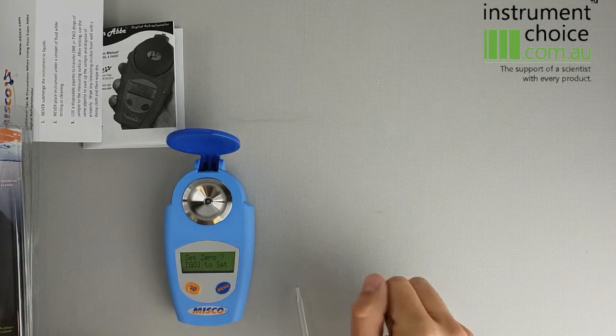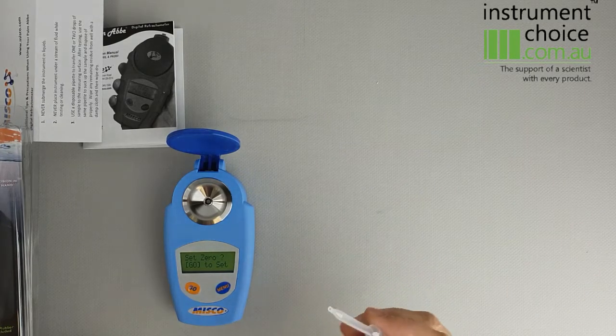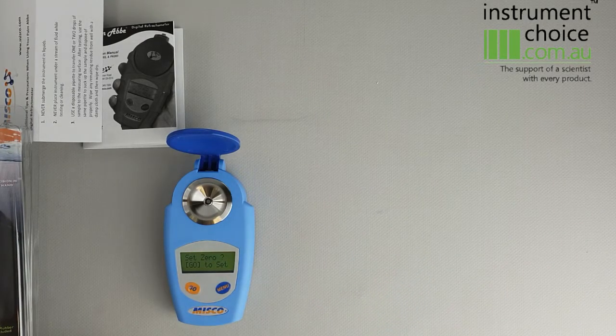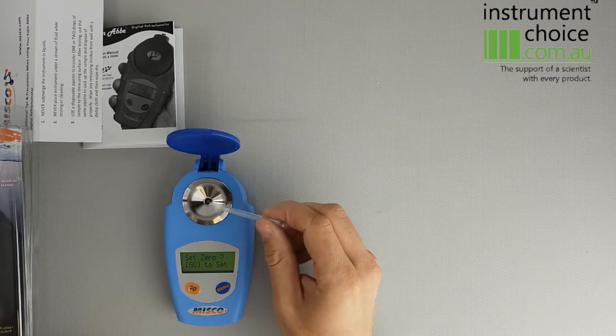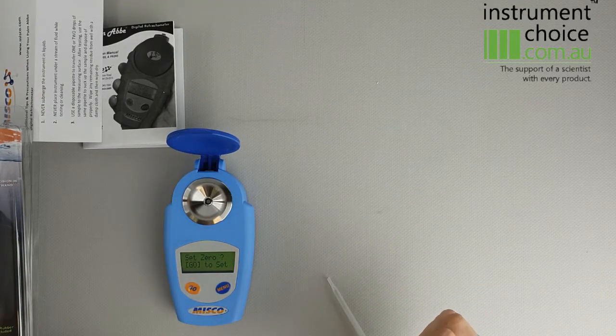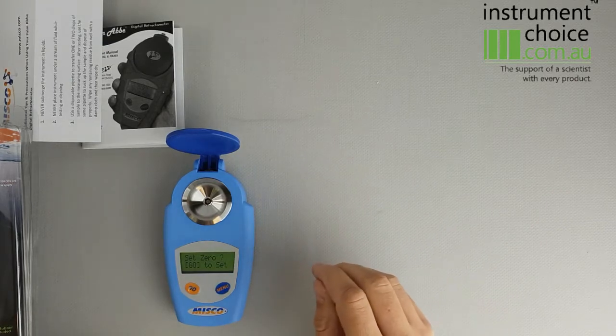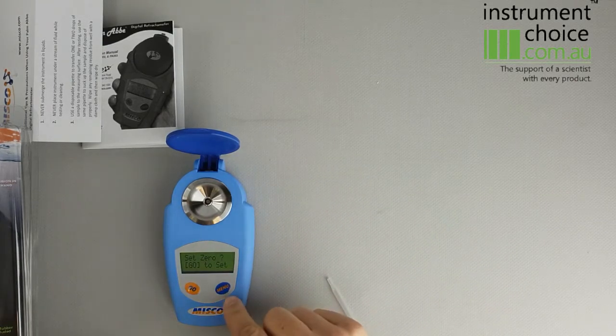To do your calibration, you essentially put a small amount of distilled water straight into the prism and you'd hit GO. That would then calibrate the instrument. You could then start with sampling.